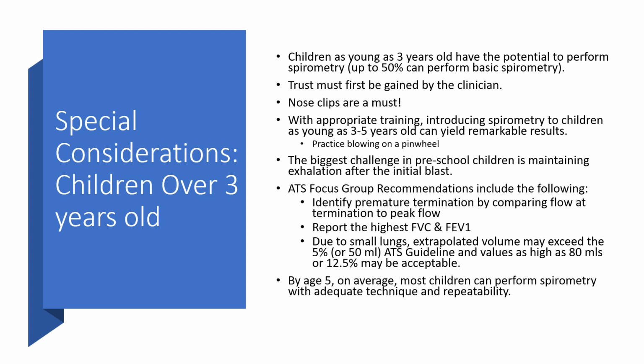Due to their small lungs, extrapolated volume may exceed 5% or the 50 mL ATS guideline, and values as high as 80 mL or 12.5% may in fact be acceptable. So there's kind of a loosening of the ATS guidelines of what we would regard as an acceptable study in the younger patient population.